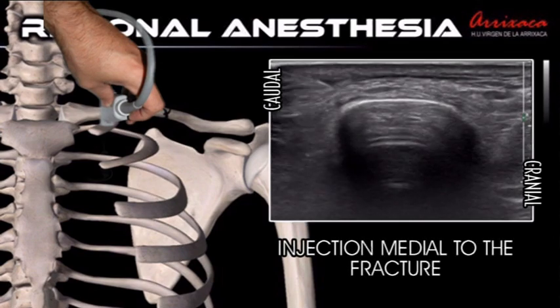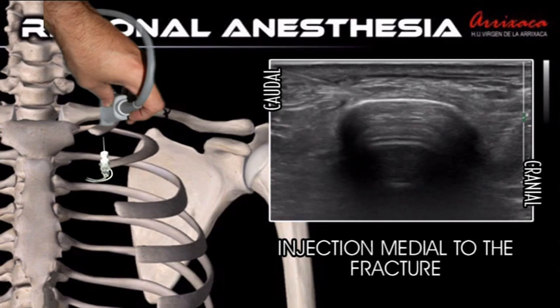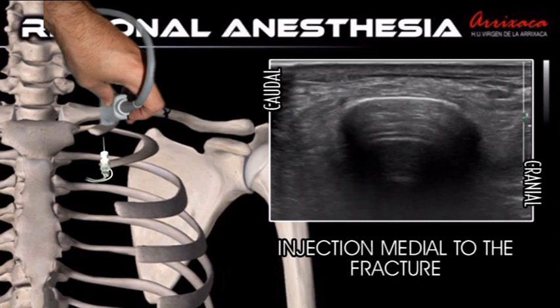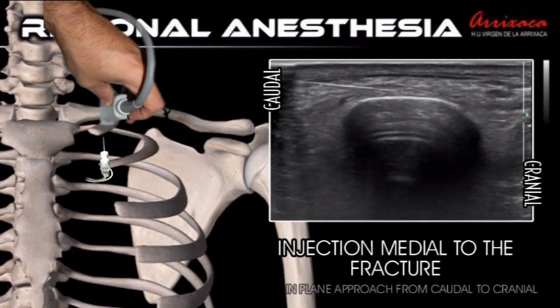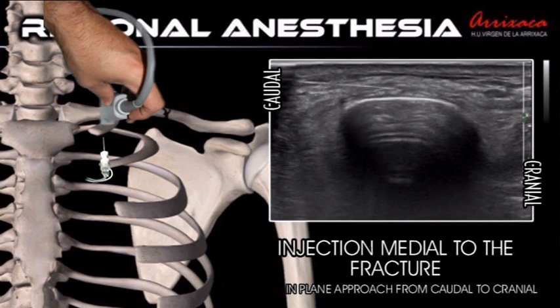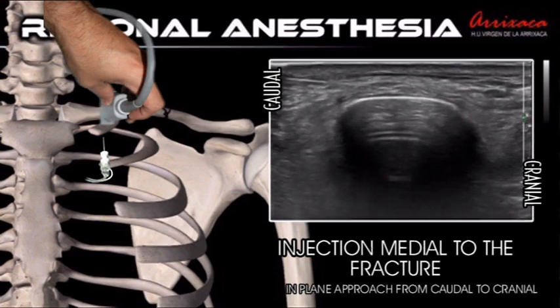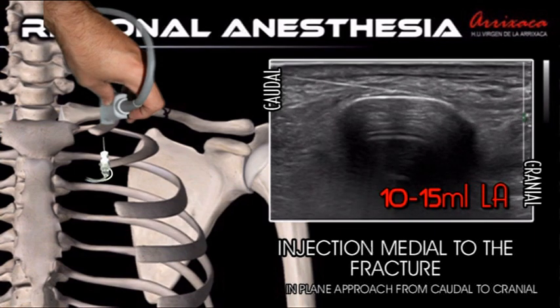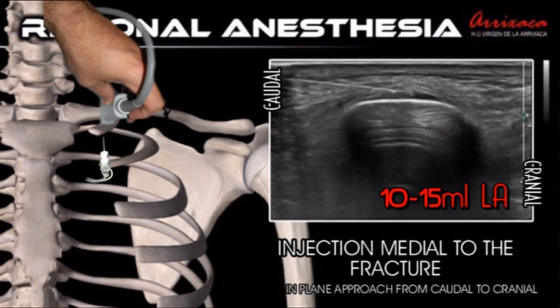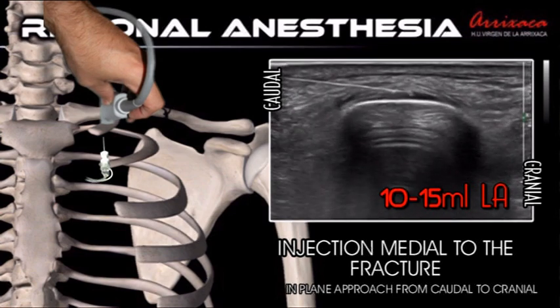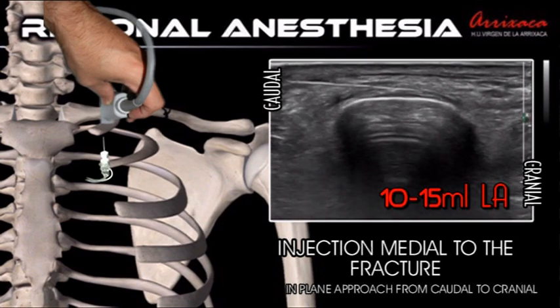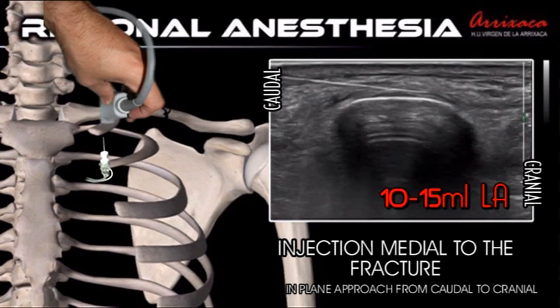The needle is inserted in-plane from caudal to cephalic, and the local anesthetic is injected between the periosteum and the clavipectoral fascia. This is a simple and highly safe procedure that will provide anesthesia and prolonged analgesia for mid-shaft clavicle fractures.